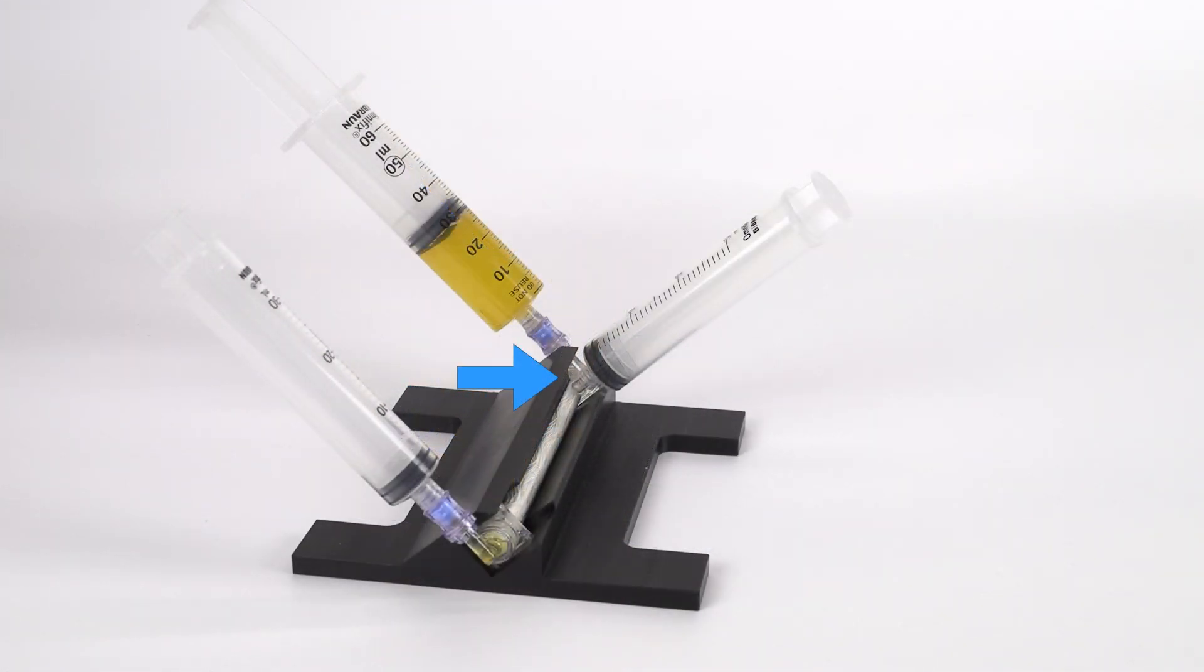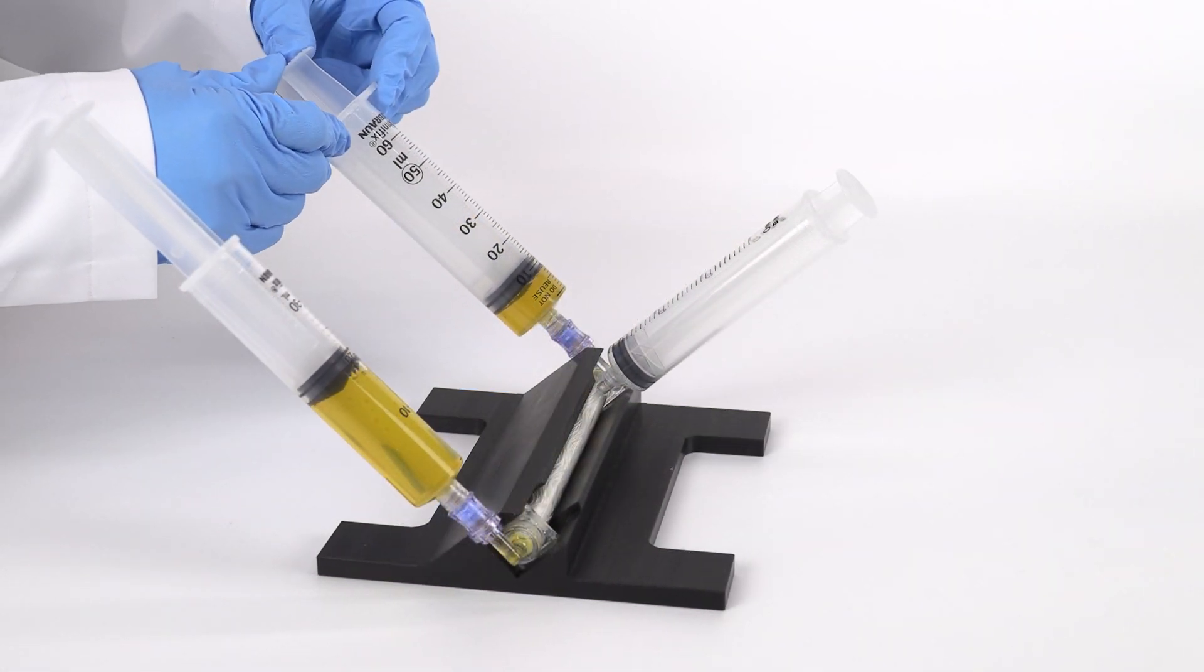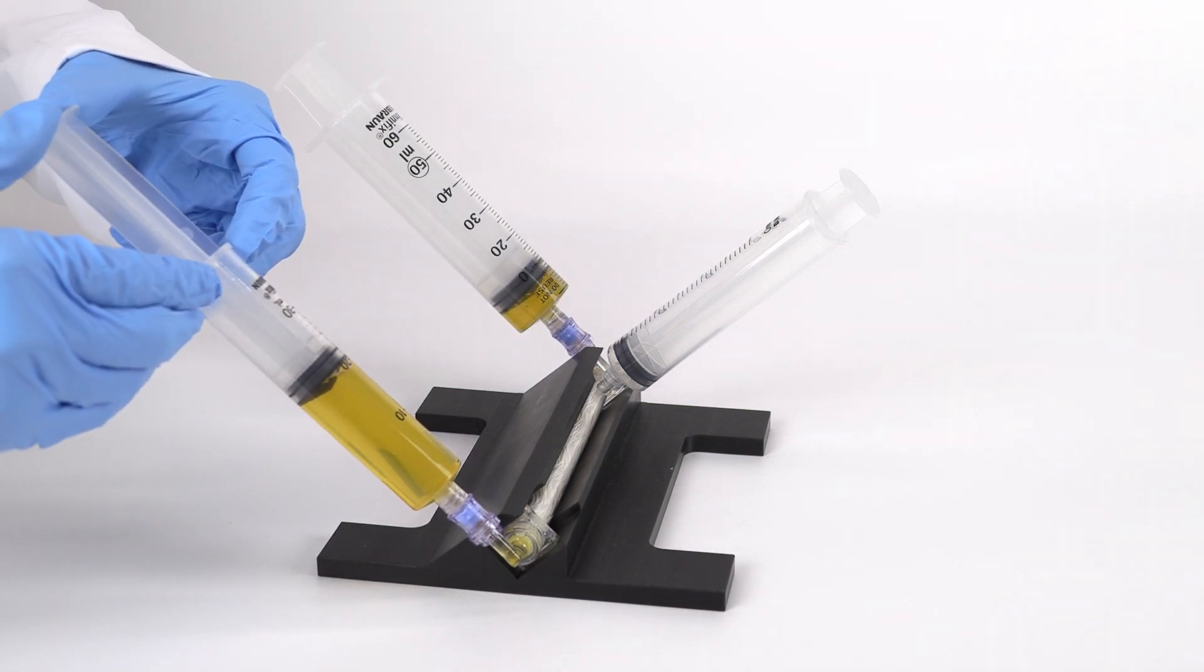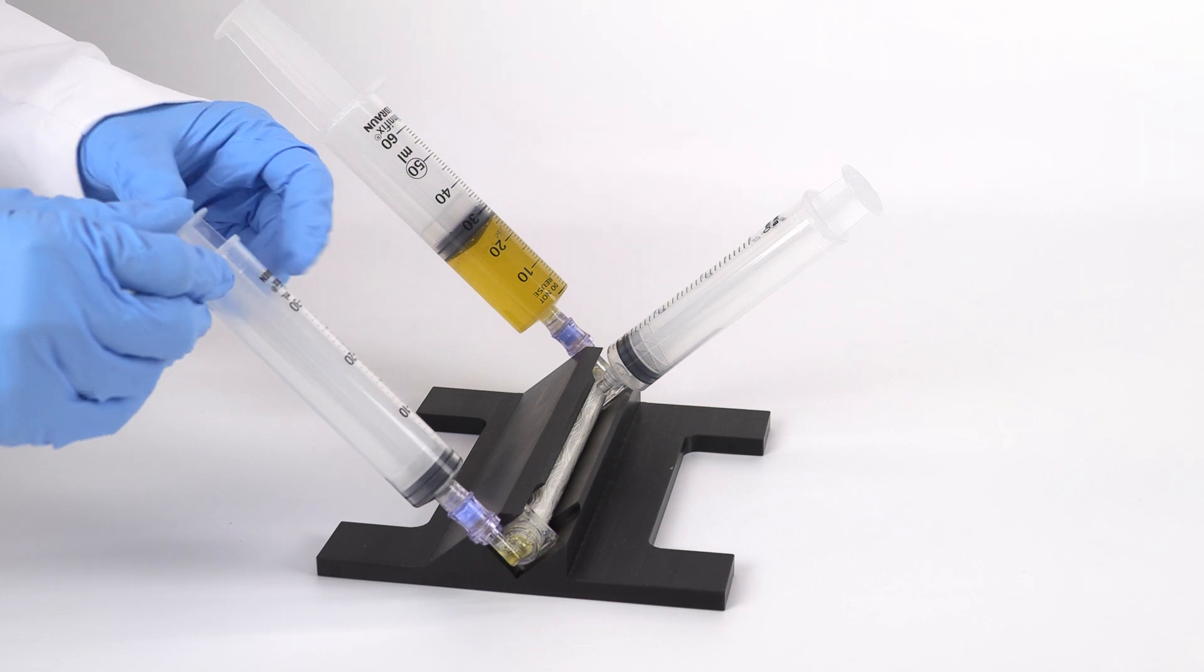Break the seal of the effluent syringe. Remove the red cap and attach the syringe to the effluent port. Begin the filtration process by injecting the plasma back and forth through the syringes until the plasma volume reaches approximately 10 milliliters.